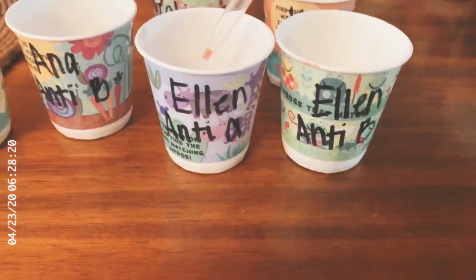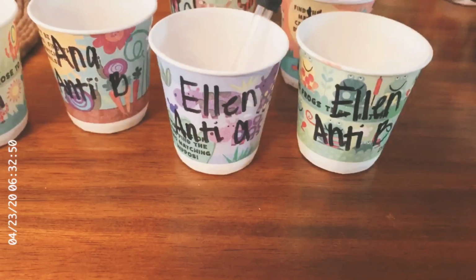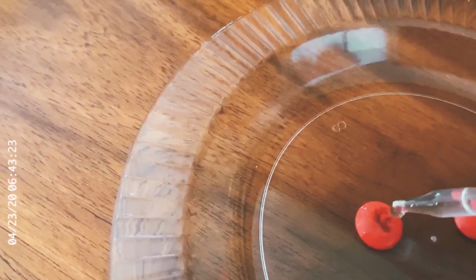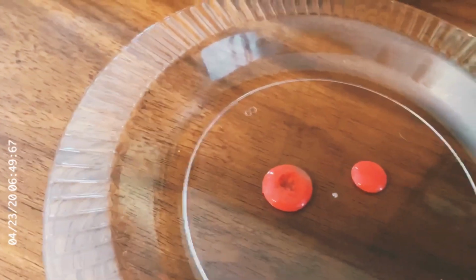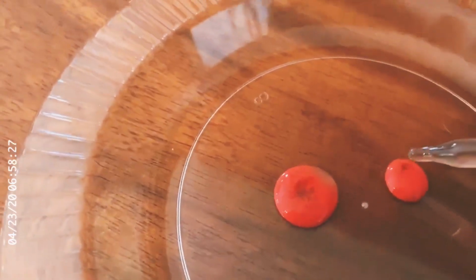So we're getting a little bit of anti-serum. Oh, I still have some blood in my pipette. Let's get a little bit of Ellen's anti-serum A, and we're gonna go ahead and put it into Ellen's blood. Then we're gonna get a little bit of anti-serum B, and we're gonna put it into the other blood drop.